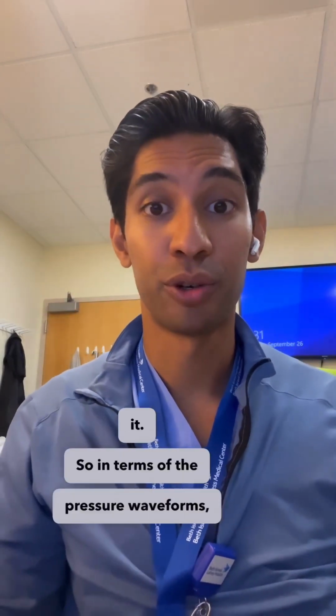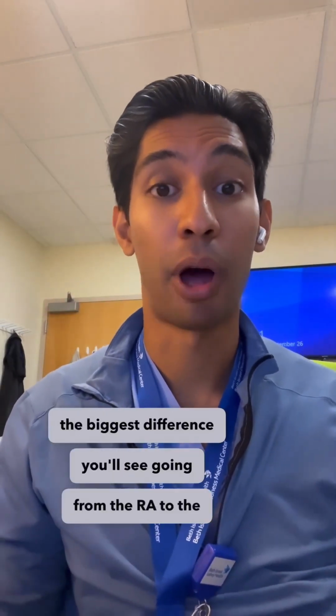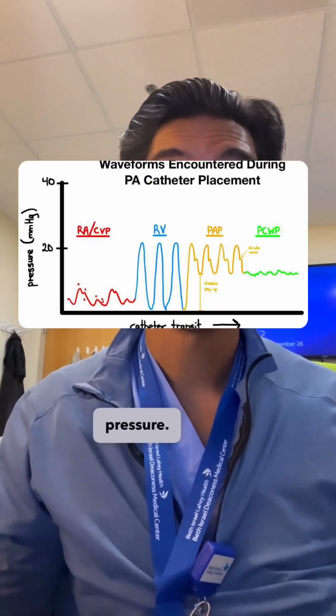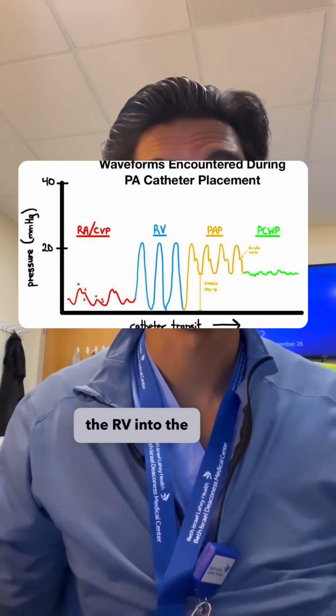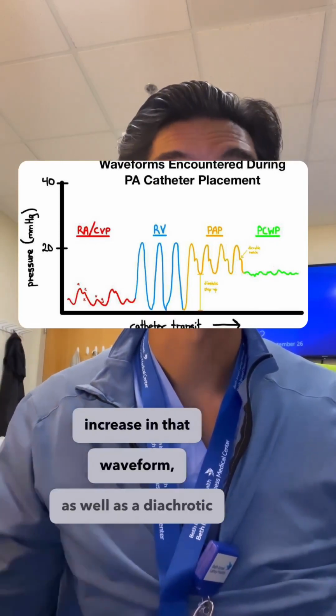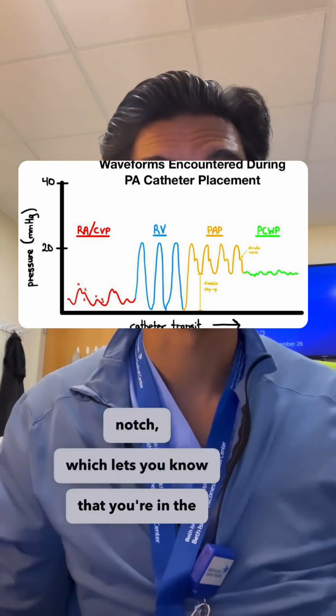So in terms of the pressure waveforms, the biggest difference you'll see going from the RA to the RV is a big increase in the systolic pressure. And then as you're transitioning from the RV into the pulmonary artery, you'll see a diastolic increase in that waveform, as well as a dicrotic notch, which lets you know that you're in the pulmonary artery.